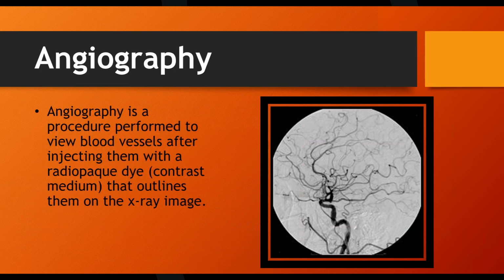All right. So what I just described to you is referred to as angiography. Angio means blood, ography means the viewing of, so angiography is the viewing of blood vessels. It's a procedure performed to view the blood vessels after making them radiopaque.